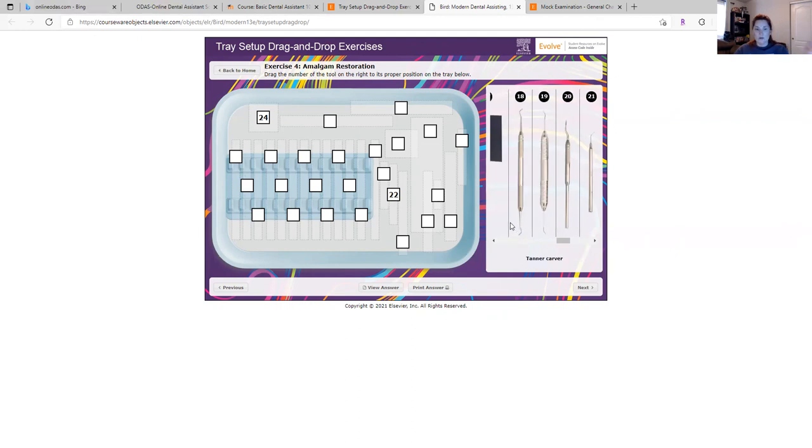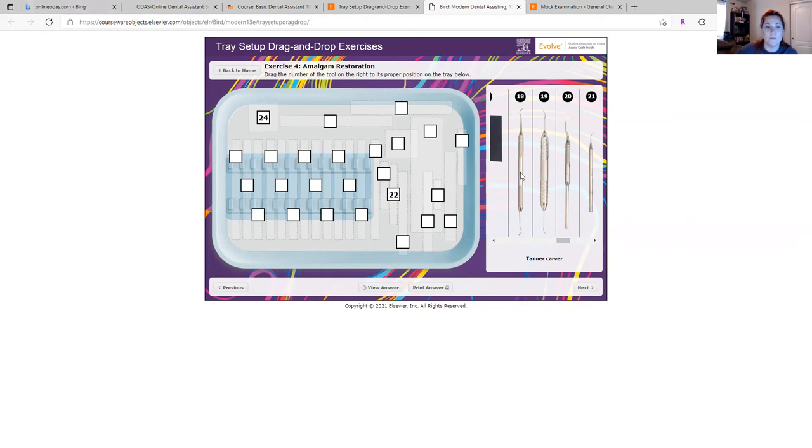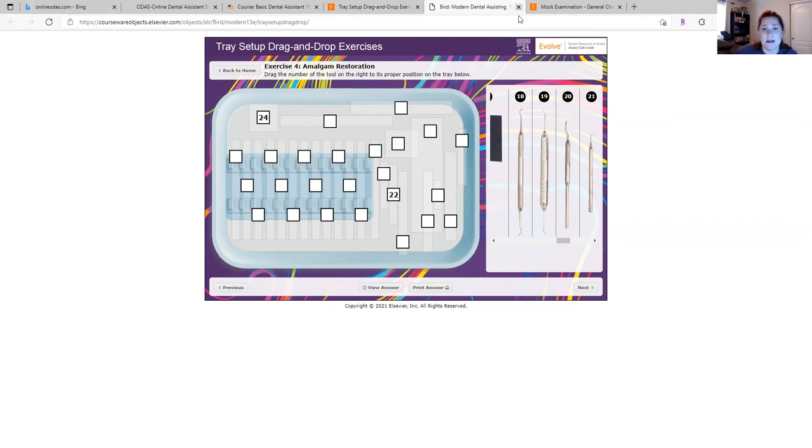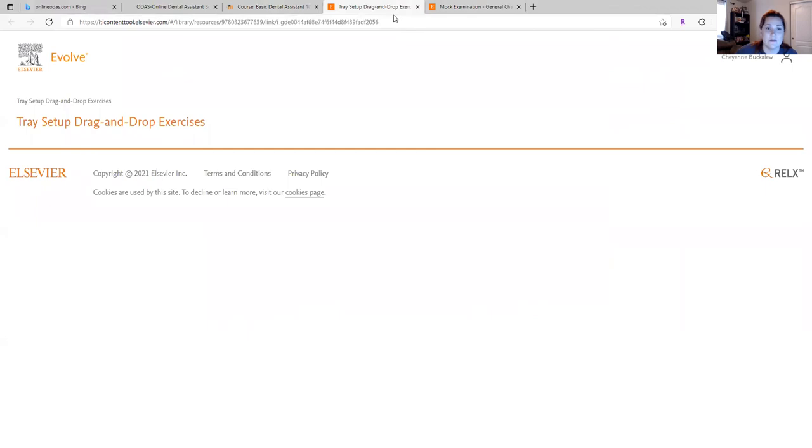But yeah, you go through and place the instruments, but again, it's about learning what the instruments are and what they're used for and what procedures. So again, a great exercise that I wasn't able to find anywhere else on the internet. It's just a good program. There's just a lot of information.